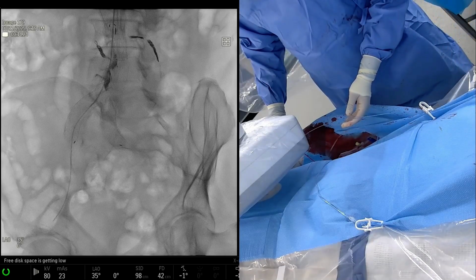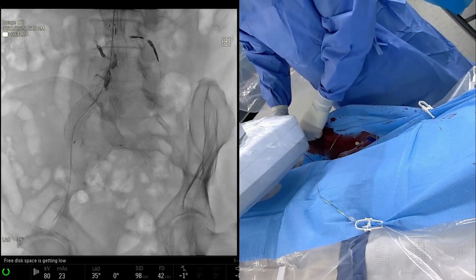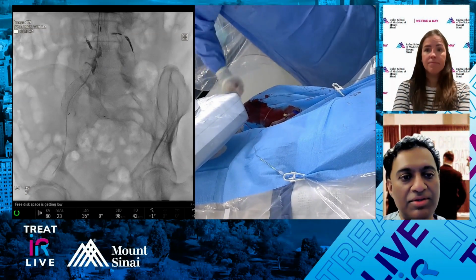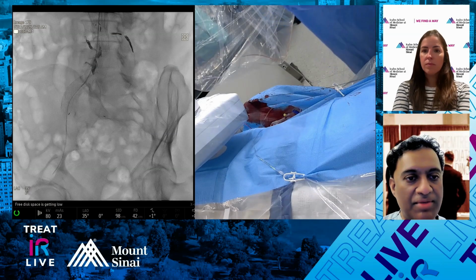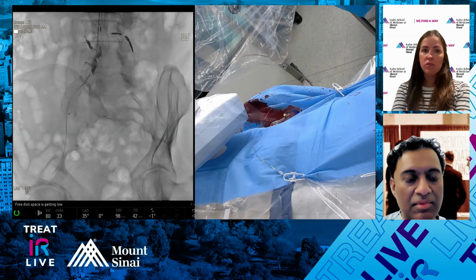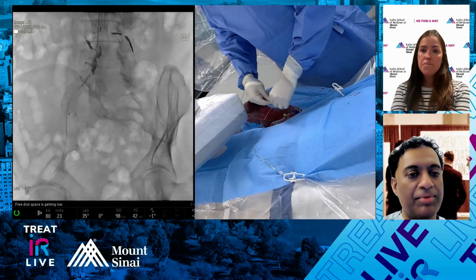So now obviously the Sarah's, well, go ahead. Sometimes with the lip of the graft, it can be tricky to cannulate the ipsilateral internal, depending on how low the limb is or how angled it is. And so it's sometimes a little tricky to get in either from the ipsilateral approach or even probably from a radial, from an angulation standpoint. So femoral on these, Joji? I do tend to do a transfemoral approach.